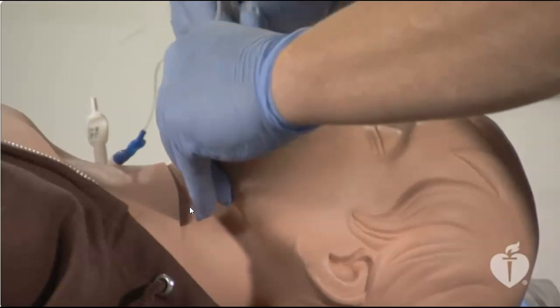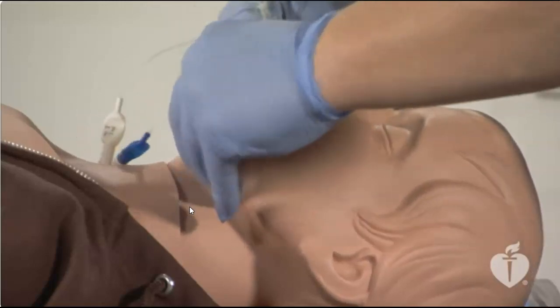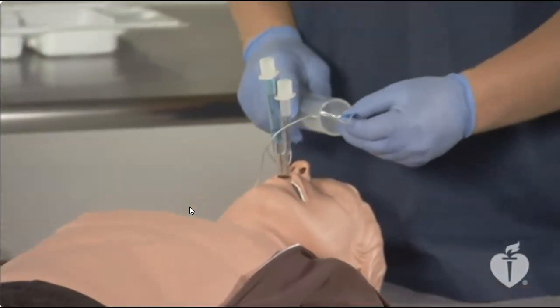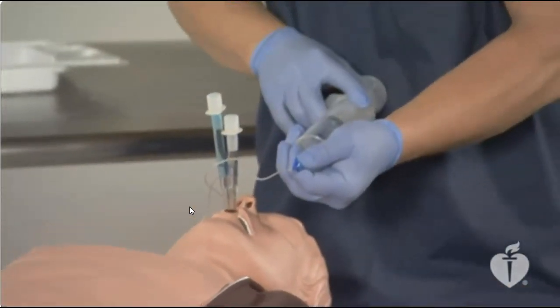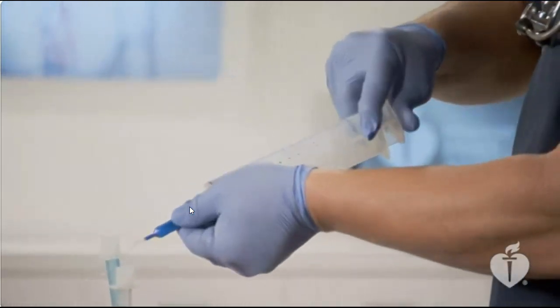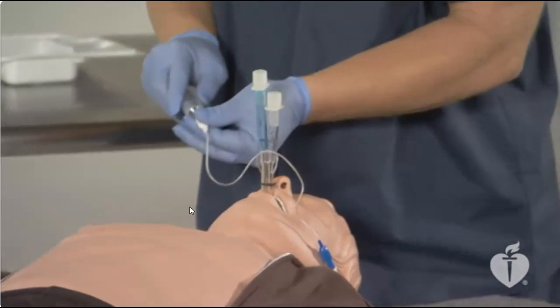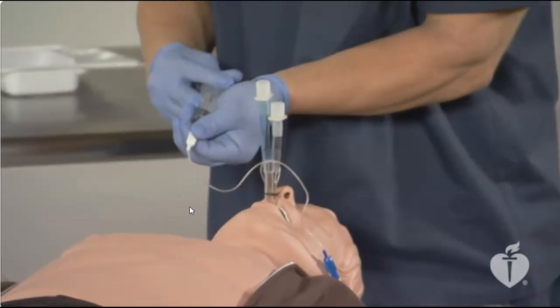Advance the tube smoothly but continuously until either the teeth or the ridge of the gums is between the 2 black rings on the tube. Do not force the tube. Keep the device in a midline position by aligning the black stripe on the tube with the nasal septum. Once the tube is situated, use the large blue syringe to inflate the pharyngeal cuff through the port labeled number 1. Then use the smaller syringe to inflate the distal cuff through port number 2.